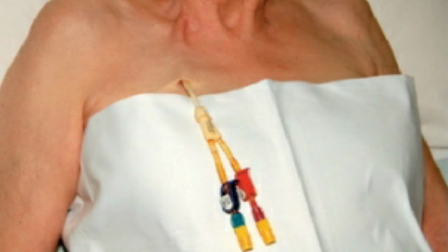The Y end of the catheter, so it's going to be a long tube with the tail of the Y, so it's going to be upside down. So the 2 tails of the Y, the 2 strokes of the Y, are going to be sticking out and the tail is going to be sticking in. So they are 2 flexible tubes at the end of the catheter or dialysis line, which are connected to the plastic tubes or blood lines during dialysis.